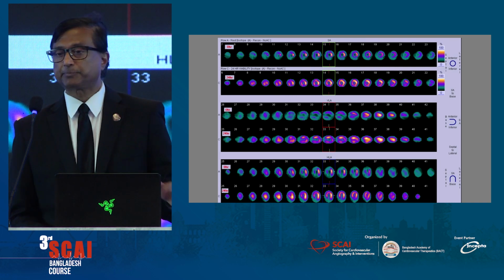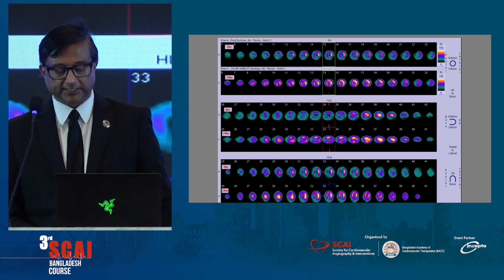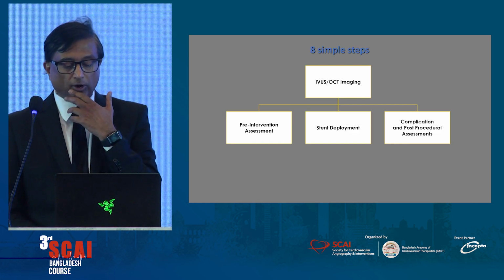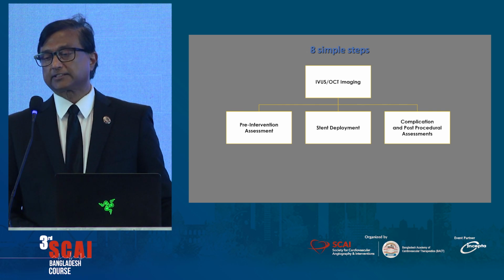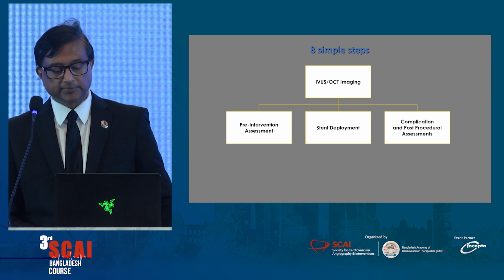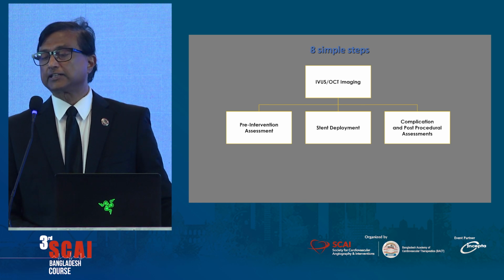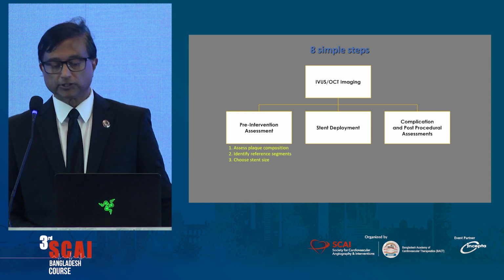We, nevertheless, in this patient did the viability scan, and you can see lots of viability, particularly if you look at the LAD territory. So we now wanted to see how we can prepare this patient for the best PCI outcome. We need to do a few things: the imaging before and then after, and then make sure there is no complication from the procedure.